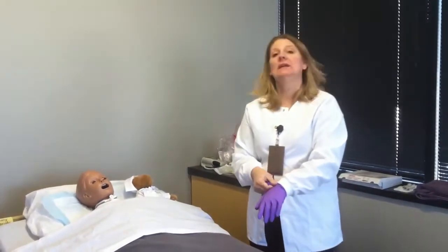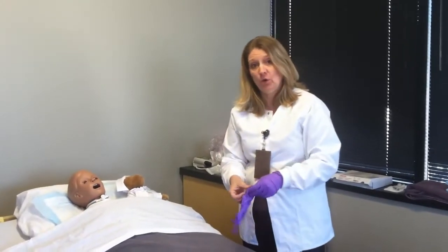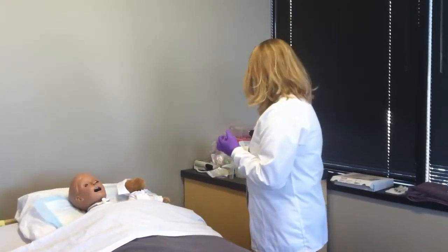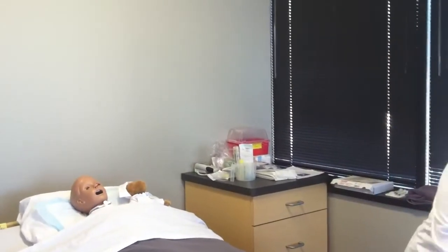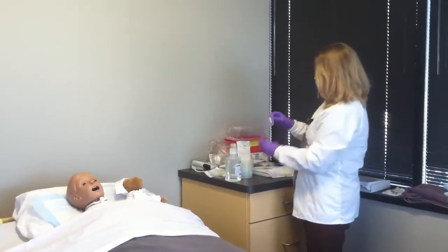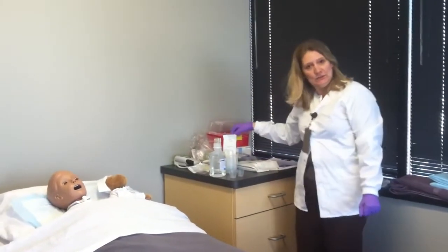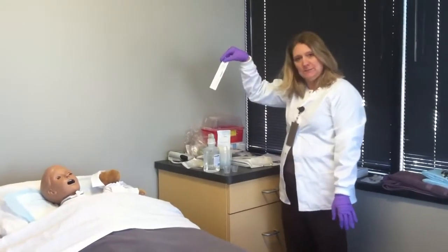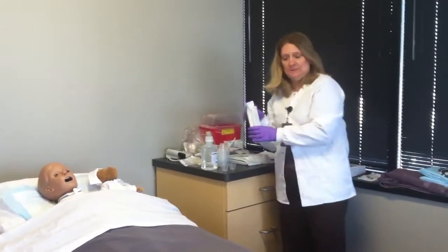The supplies are going to be Q-tips, a washcloth with soapy water, mild soap for cleaning the site, sterile water, and medicine cups, little med cups. So I'm going to just gather the last of my cups and everything. What I usually do is I put 2 med cups out, and then I get my Q-tips. For GTube Care, you do not have to use the sterile Q-tips that are all enclosed in their own packaging. You can use just regular Q-tips.